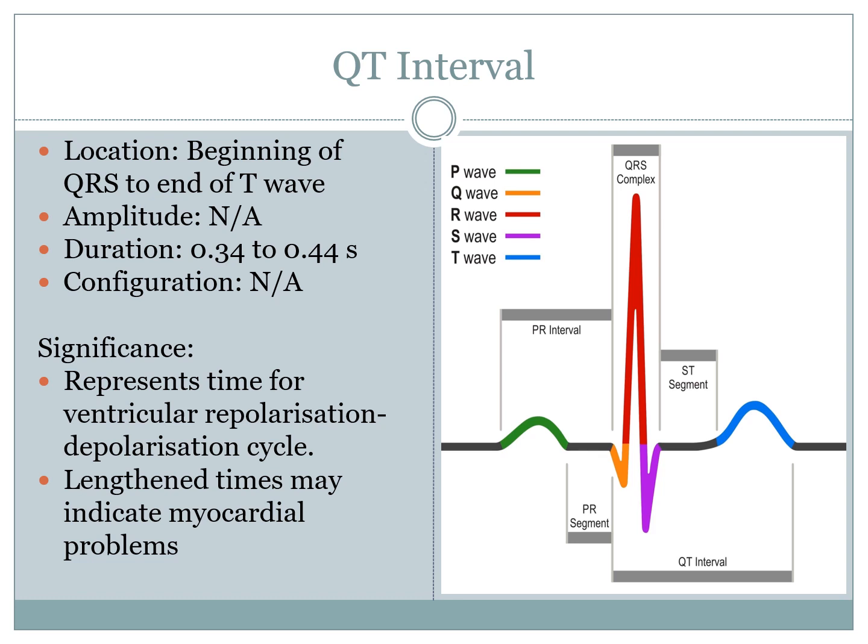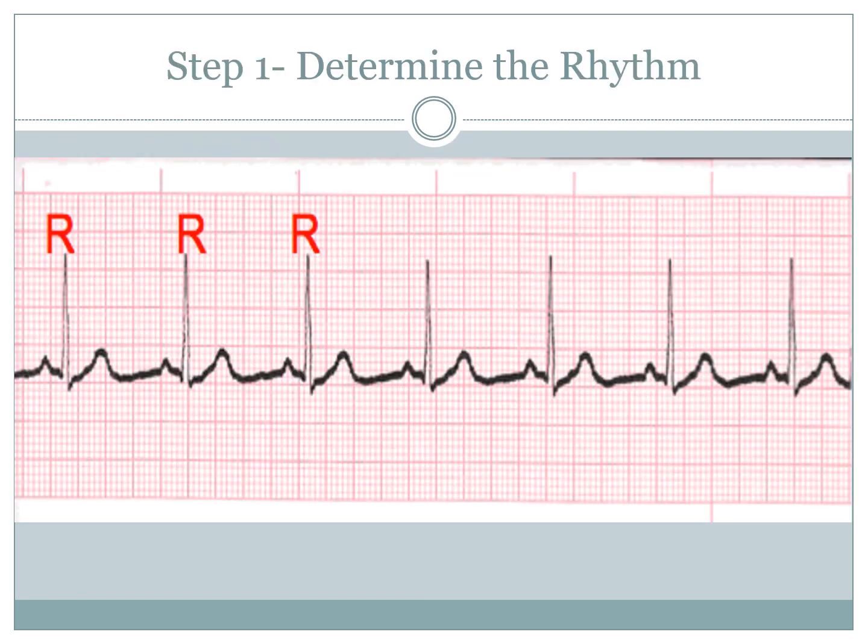Next thing we're going to move on to is steps that you can take in order to assess an ECG. Now I know you've all been through a whole bunch of these before in the past, so I'm not giving you the step that you are supposed to adopt. I'm essentially going to give you all the rules to look for, both a quick one and a slow methodical one. Because the idea is you'll take these steps away and you'll practice them.